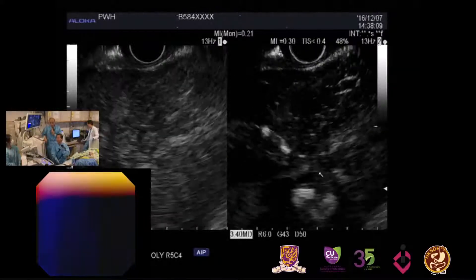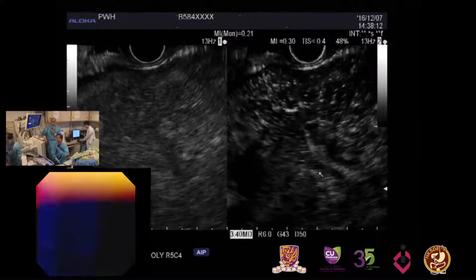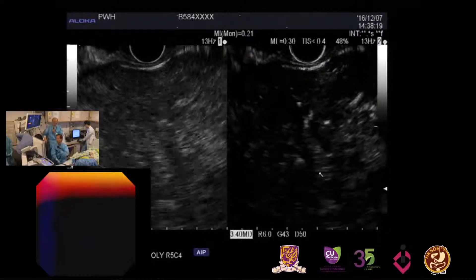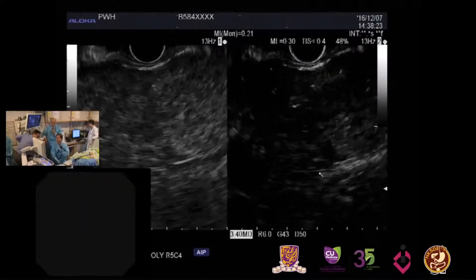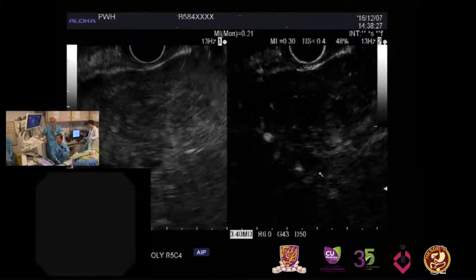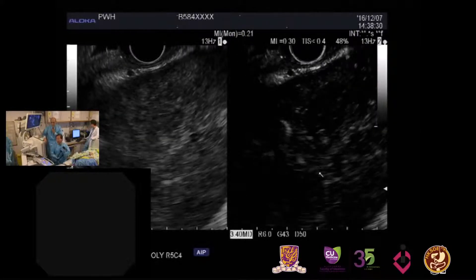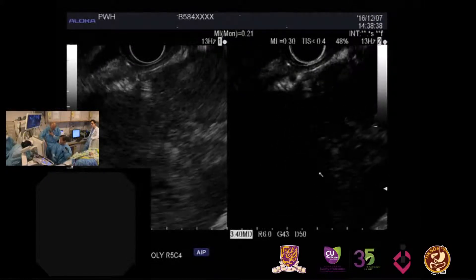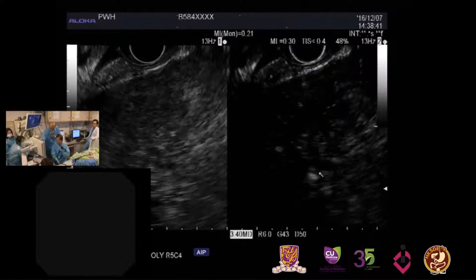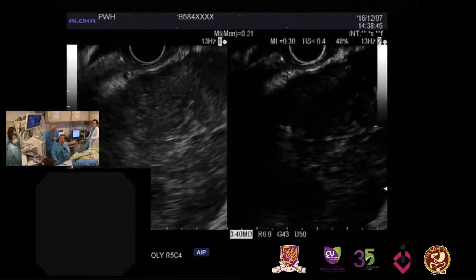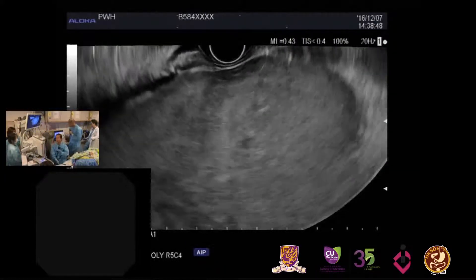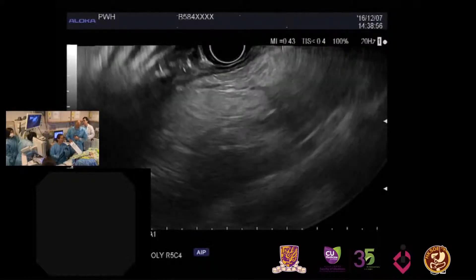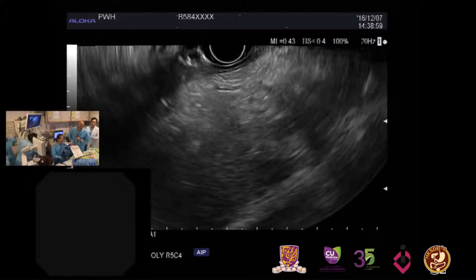So you would say this is heterogeneous enhancement? Yes — heterogeneous mixed enhancement, and the tumor vessel is very strong. For benign lesions we cannot see this kind of very strong and big tumor vessel, but in this case we can see quite a large tumor vessel. So every finding is suggestive of malignant GIST, but histology — nothing can replace histology — so we better do EUS-guided biopsy. For GIST we need to get a larger tissue amount if you want to do immunohistochemical staining.